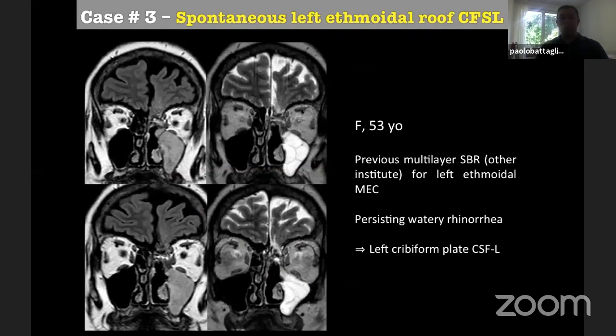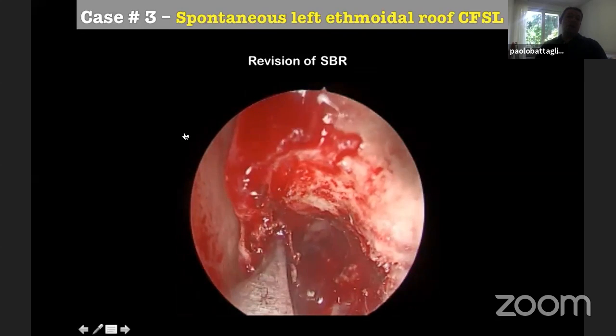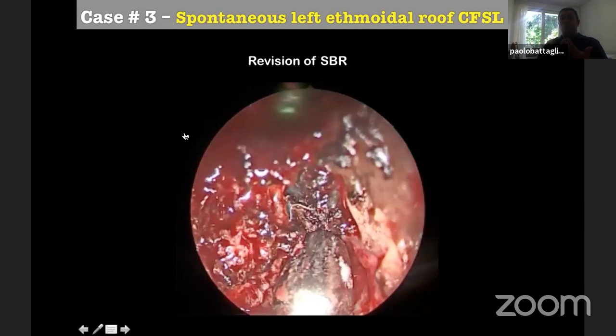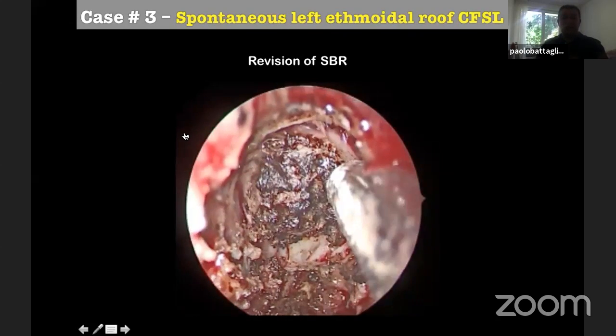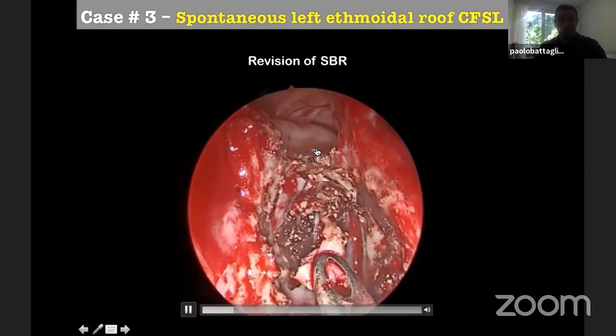So first option, how would you deal here? It's a recurrence. The patient was obese, so probably with hypertension, and of course, I know that there will be scarring tissue at this level where there was this meningoencephalocele. So at the first time, I thought to use a Haddad flap. And this is me here working, so I performed both surgeries, with the Haddad and then with the flip flap the last time. So let's see, posterior frontal sinus, posterior wall.